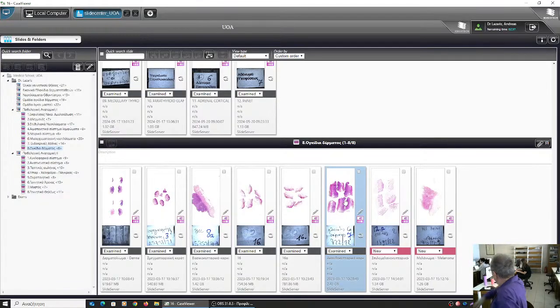Yes, please. The solar elastosis. The solar keratosis. Yes. That's either solar keratosis or actinic keratosis. I think it has two terms. Okay. Professor? Yes. When would we call the dysplasia carcinoma? When we see invasion through the basement membrane. If they go in the dermis, then the malignant transformation has occurred. They start invading. Here everything that has happened within the epidermis is intraepithelial neoplasia. No malignancy, but it has a malignant potential.